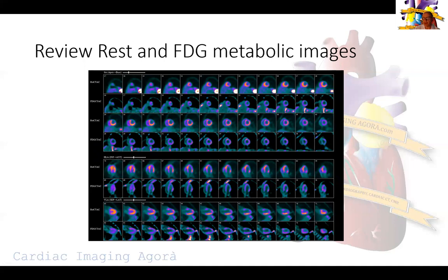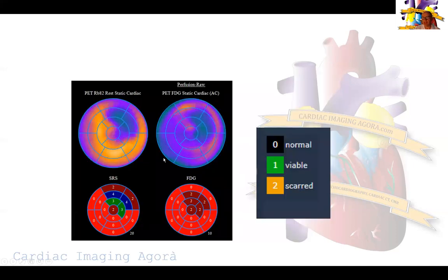Next we look at the FDG images to see if there is any uptake in the area of the rest defect. In the FDG images there is no uptake — the defect seen on rest images is also present on the FDG metabolic images. Therefore this is by definition scarred myocardium: a matching defect between the rest images and the FDG images. We scored these segments following the American Society of Nuclear Cardiology guidelines where a score of 1 indicates viable and 2 indicates scarred, scoring all these segments as scar in the inferolateral territory.